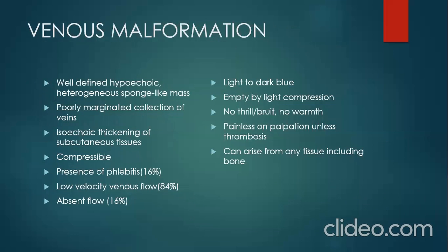Then moving on to venous malformations. Clinically, the area where we have this venous malformation is light to blue, and it empties with light compression because this is a vein. So when we compress the vein, it empties, and this light to blue color disappears.